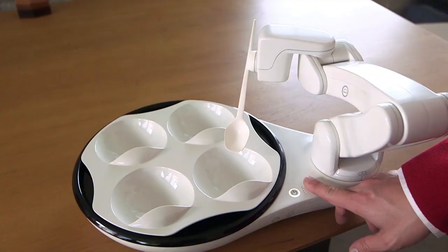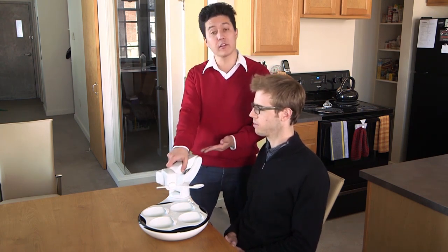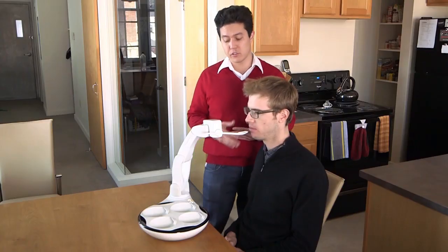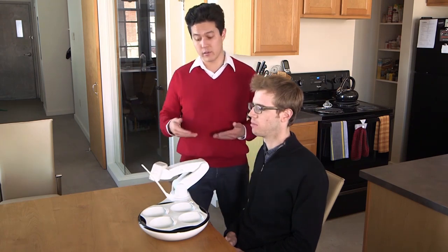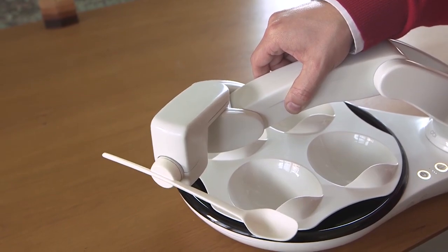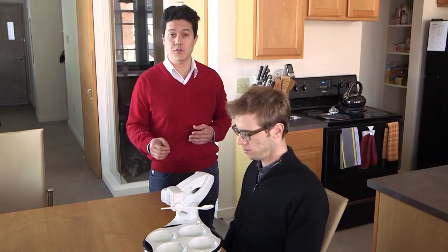Start by simply pressing the teach button on OB's base. Once OB stops moving, grasp the arm and ensure that your thumb is covering the teach icon and lift. Move the spoon to just in front of the user's mouth. Once the desired position is reached, touch the teach button again to exit teach mode and store that delivery location. There are some delivery locations that OB finds particularly stressful. If you attempt to teach to one of these locations, OB will let you know by shaking its head and quickly flashing the teach button. If this occurs, simply move the arm to a new location.